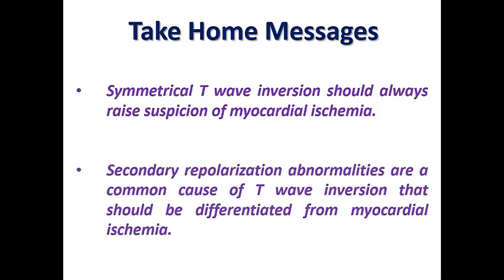And secondary repolarization abnormality is a very common cause of T wave inversion in our practice that should be differentiated from myocardial ischemia. And of course, clinical presentation is very, very important before you decide the cause.